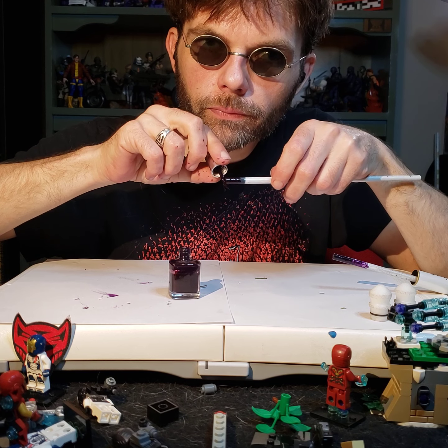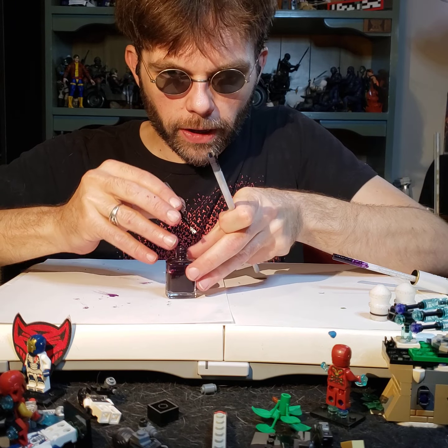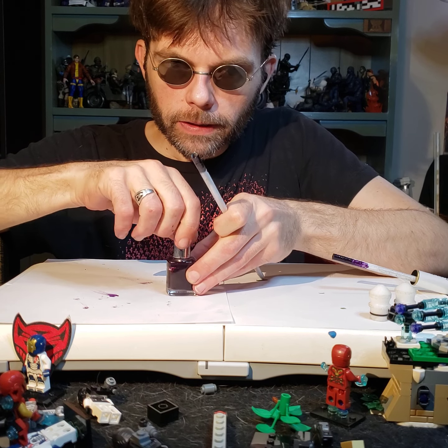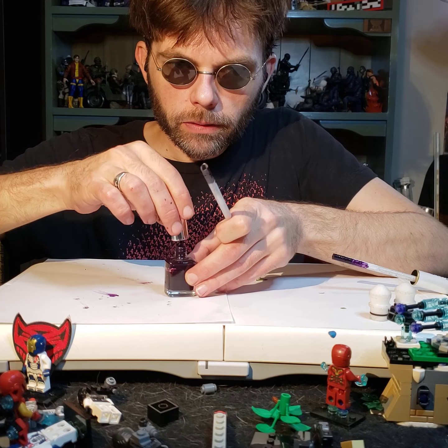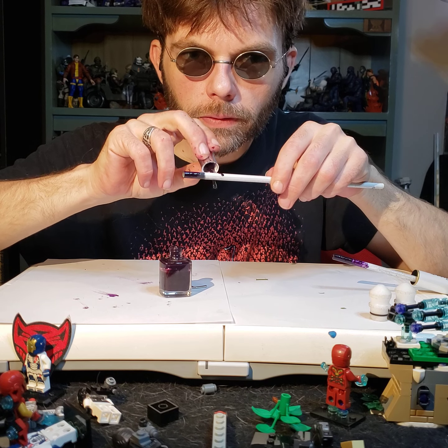There we go. Whoa, that is some fumey stuff. Okay, let's do one more layer, like we did with the other one. Go in there. Okay, screw it shut. Bring it back out. Knock off the edges because we don't want drippies. Okay.